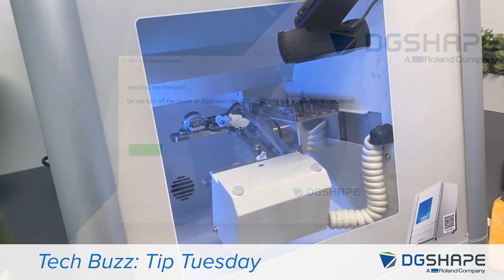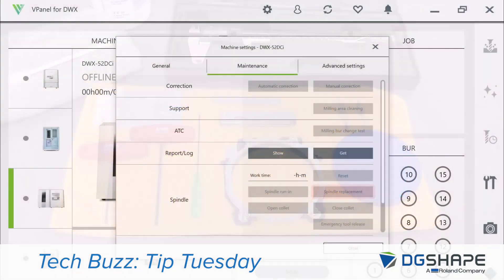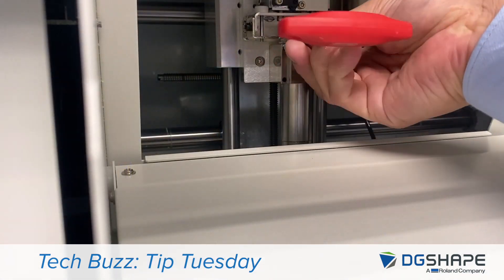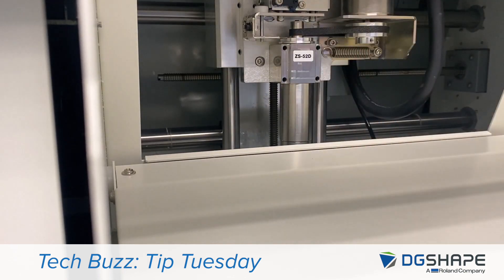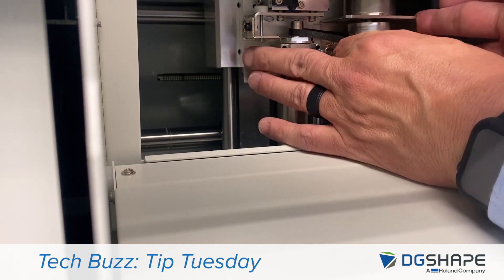Follow the easy process in installing the firmware and drivers. Next, using the spindle replacement procedure from vPanel, we're going to move the spindle into position. We're going to remove the spindle and the belt. For any questions, you can visit our support page and you'll have the instructions for replacing the spindle — it'll give you all the details.